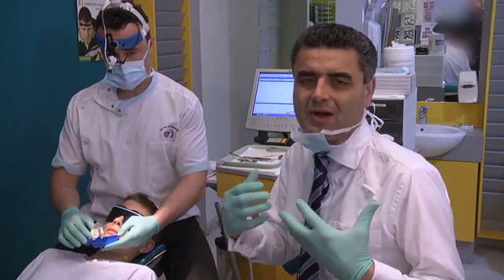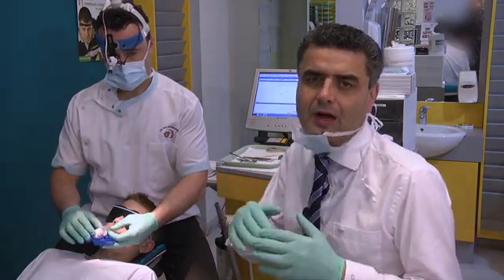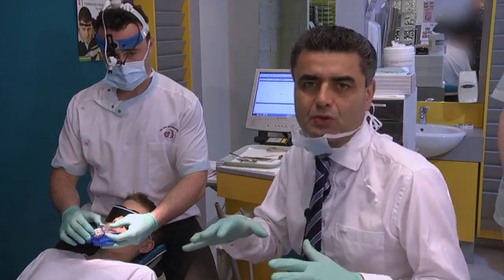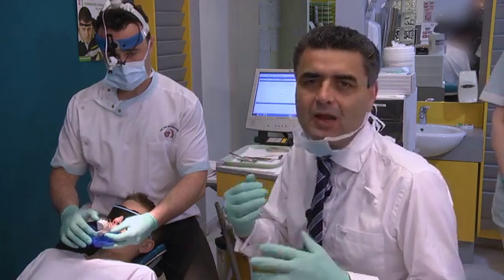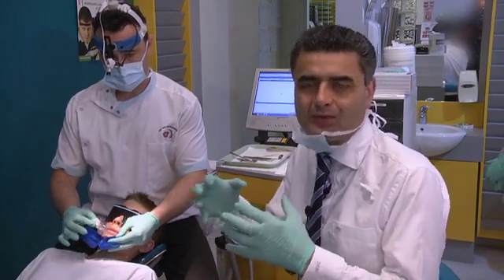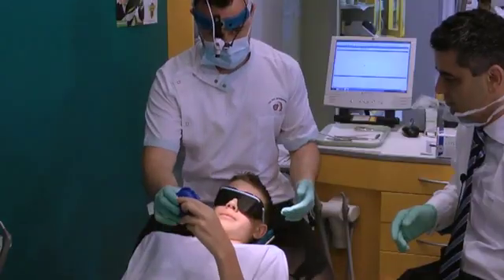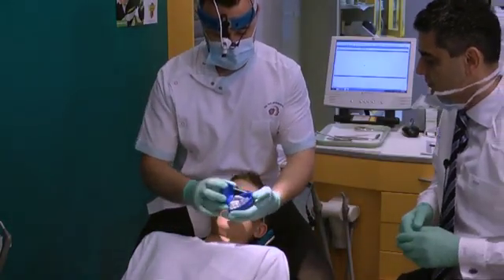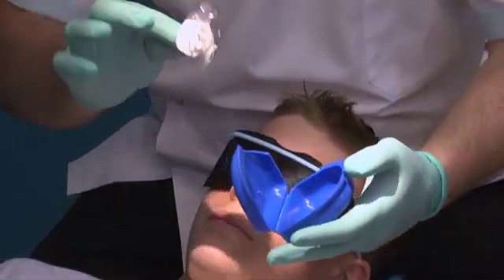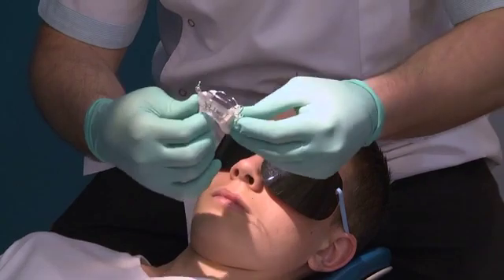We're talking about class 2 individuals that may be high angle, low angle, or neutral angle on their mandibular plane, and what keeps their jaw in class 1 as we're waiting between phase one and phase two. What we're going to do is check the appliance for any wear or breakages and make sure he's actually been wearing it.